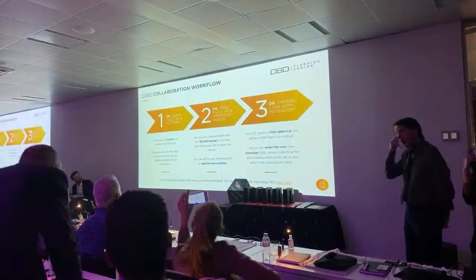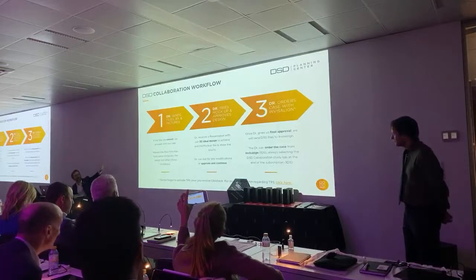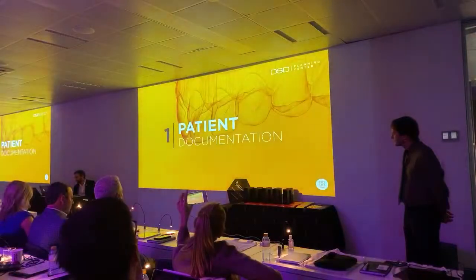That's just showing the workflow, the sequence of each case. I know if you remember before we had four steps and now we have three, because we don't have the ortho simulation anymore.